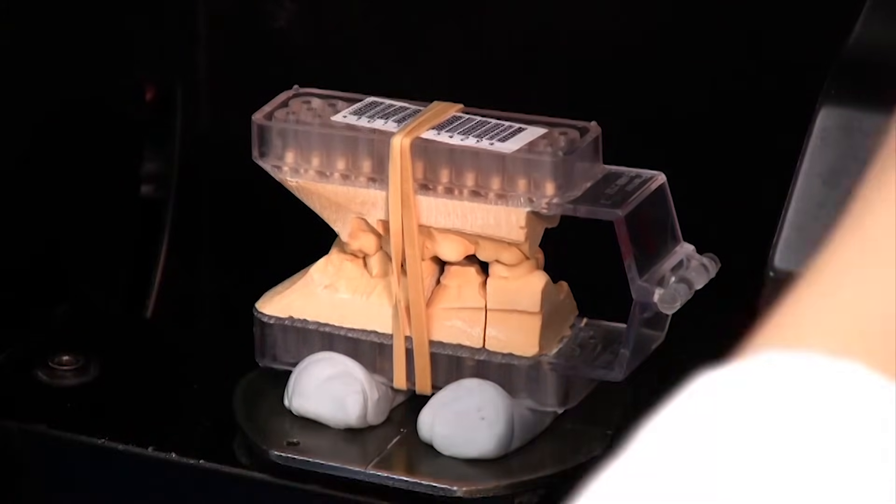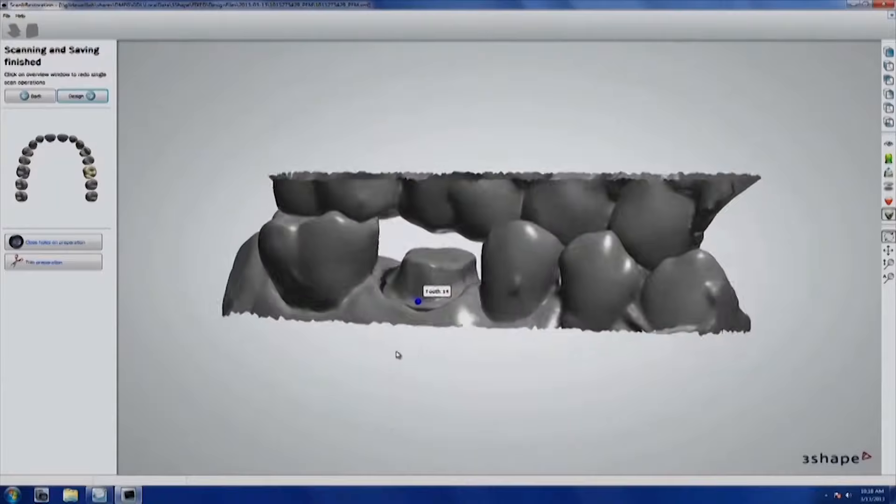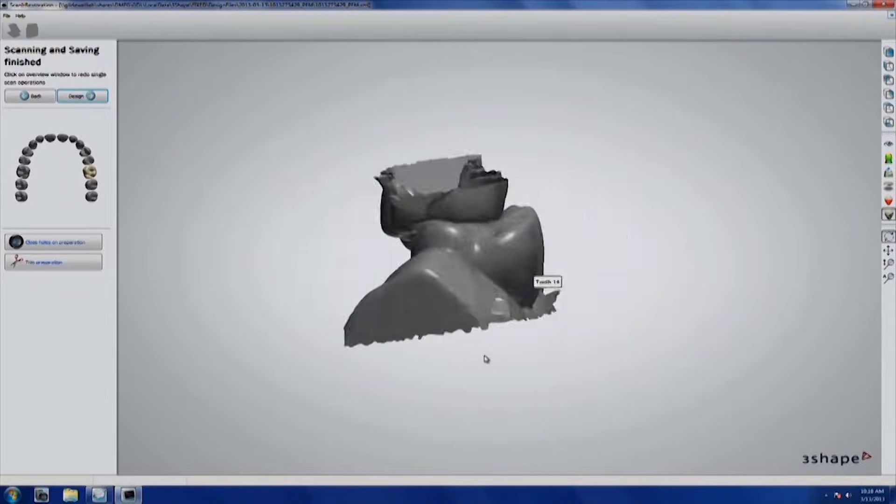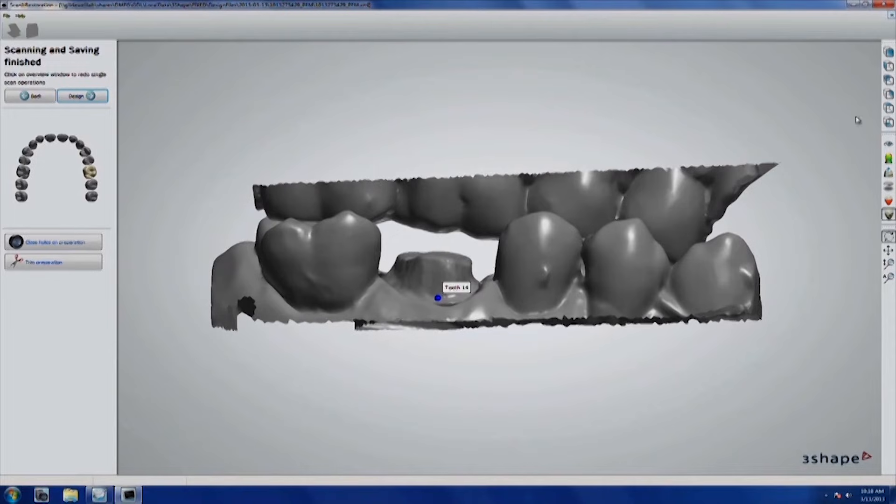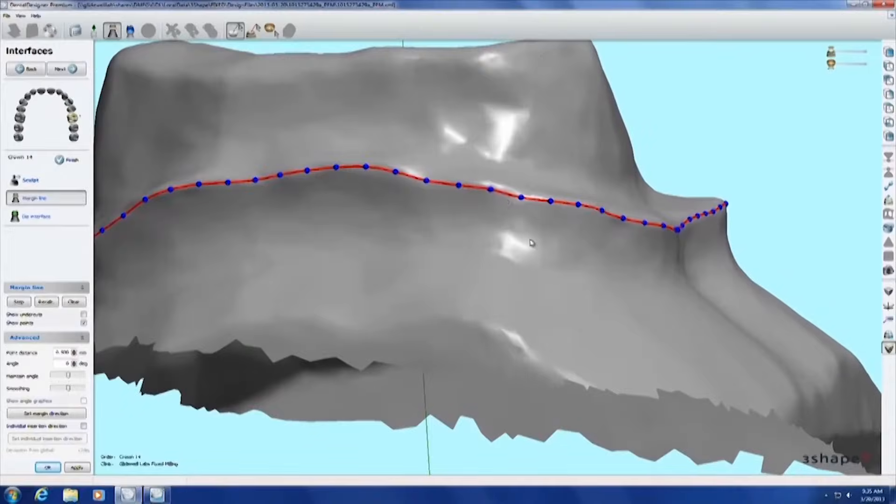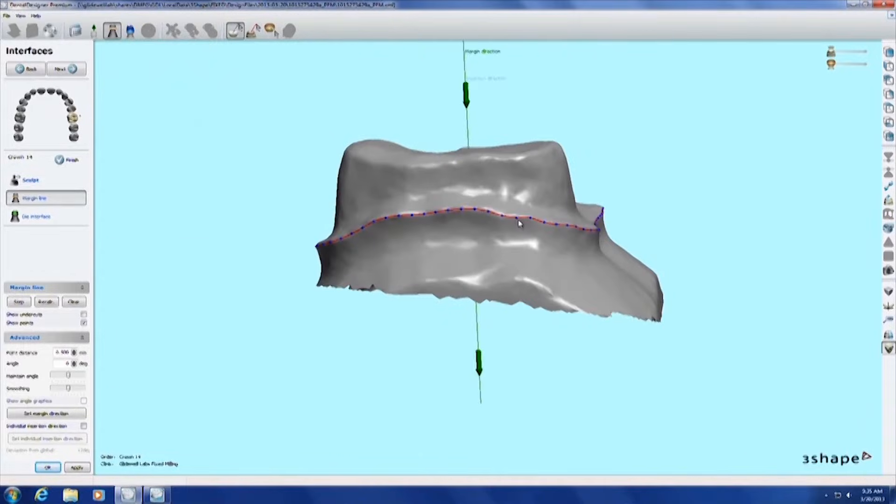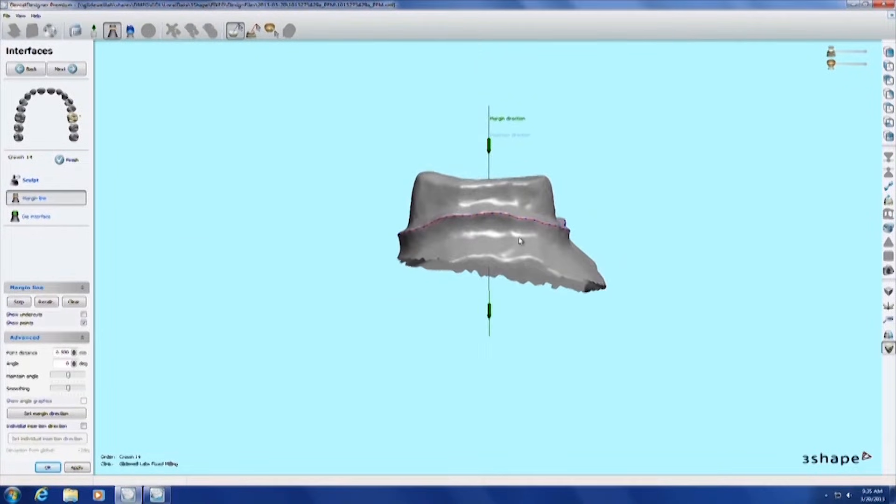There's the articulated model. So now we're going to be able to scan that from the side. And now we can see exactly how much reduction we have between that prep tooth and the opposing tooth. No more guessing on our part. And this is one of the big benefits for dentists who have digital impression scanners, is that they can see the reduction actually in the mouth.